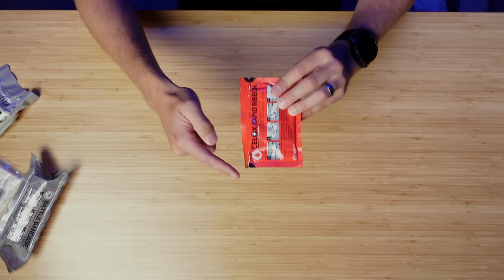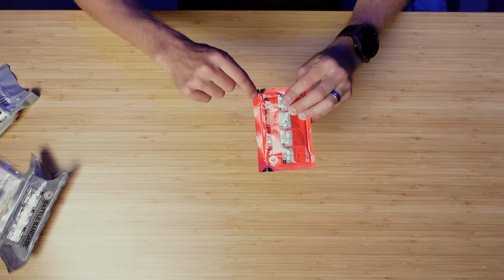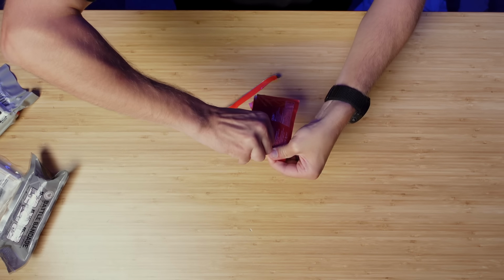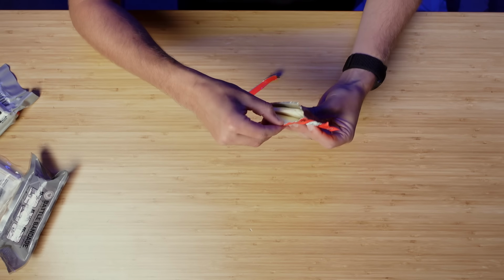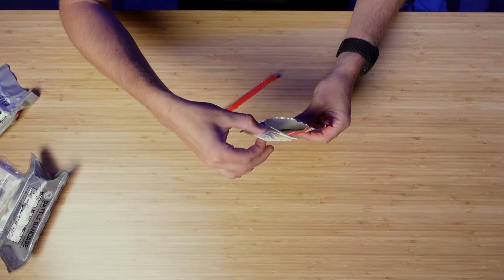So here we have two pull tabs, and they're denoted with the black. There, it's just a different color. Just tear at the top. Now, these packages aren't gonna tear super easily anywhere else, so you kind of have to go with what they've supplied you. Unlike the QuikClot, this is very messy.